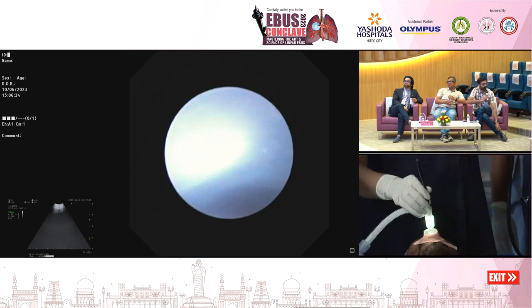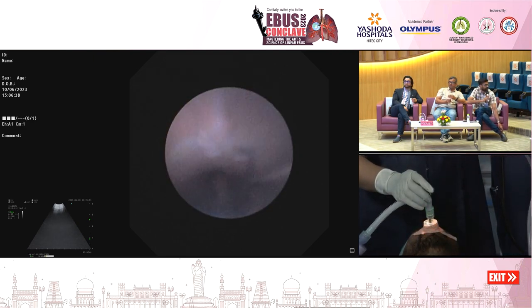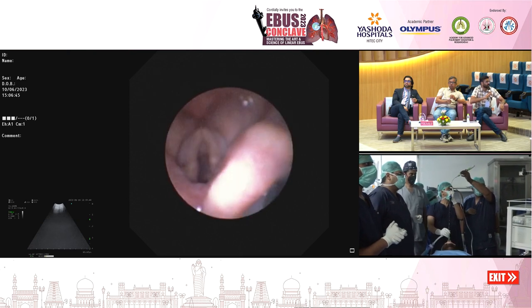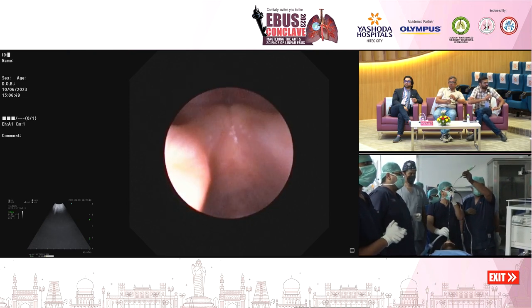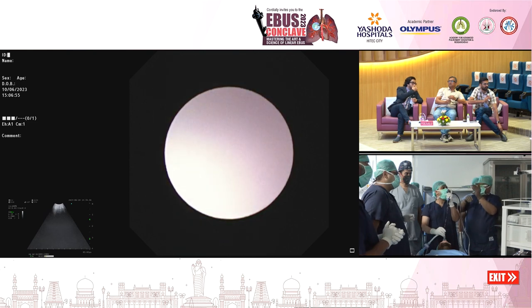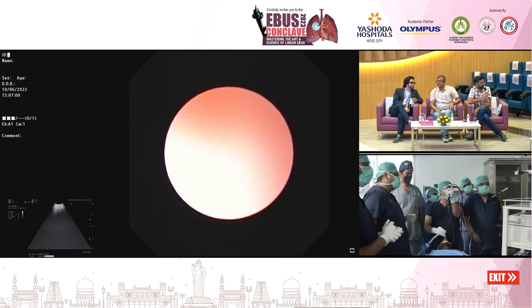Another add-on procedure is the transbronchial lung biopsy, especially in this case where the fissural nodules were seen. Even in a normal appearing CT lung parenchyma, sarcoidosis can be picked up in 15-20% additional cases if we can do a transbronchial and an endobronchial lung biopsy. But yes, many centers do not do it because of the risk of additional complications, because TBLB is the one which often ends up with complications of pneumothorax and bleed.